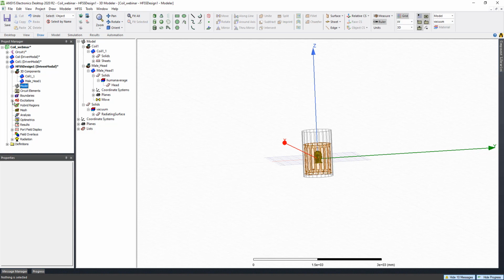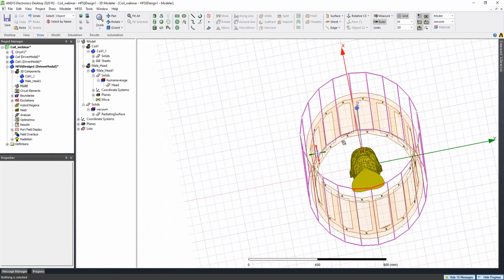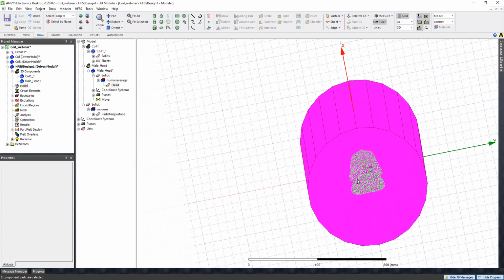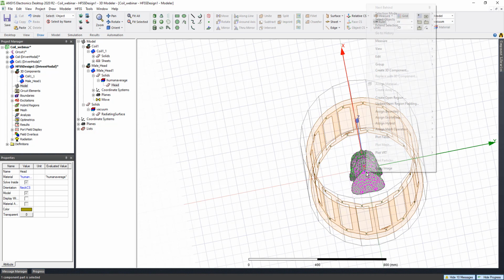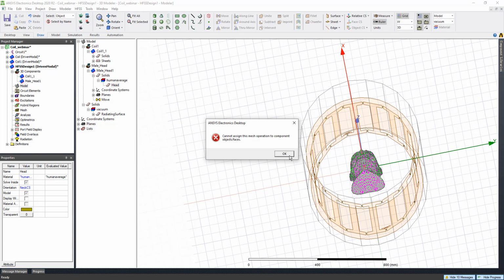We have the boundary, we have the excitation, and do I want to add a mesh? Yes, I do. I can give the human head a right click and assign the mesh to the human head. So I just select the human head, right click, assign mesh operation, on selections, to component. Oh, okay.